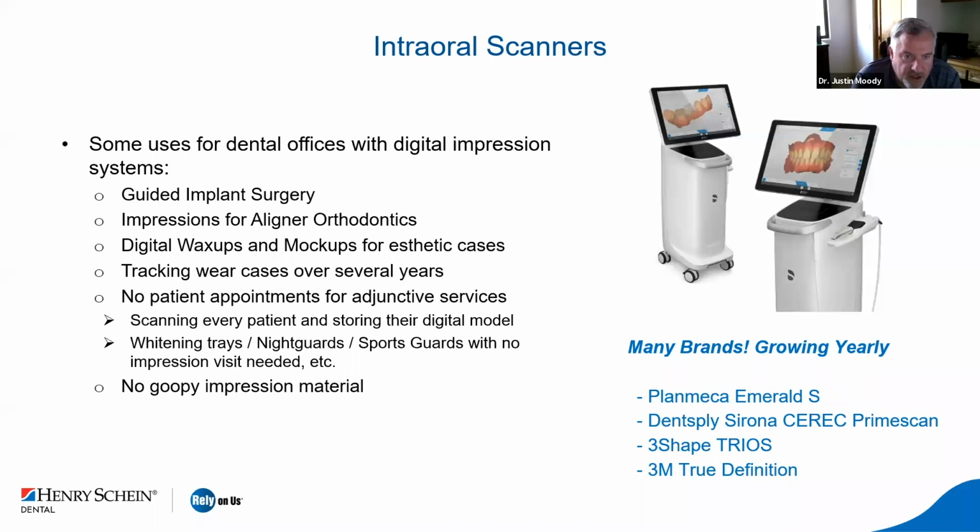I talked briefly about tracking the wear over several years. We can talk about the patient coming in with the condition that they present with, and then going through, over the years, being able to track that wear. And really, it's also about cutting down on the additional appointments that a patient needs at the clinic, having that data available to us.